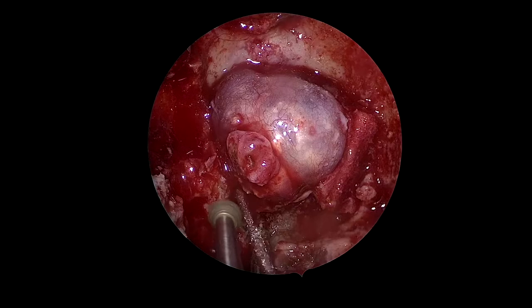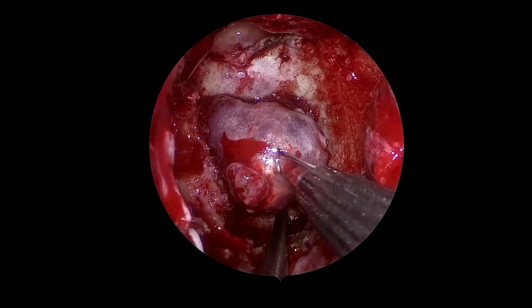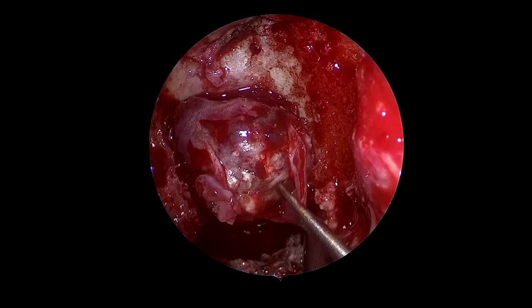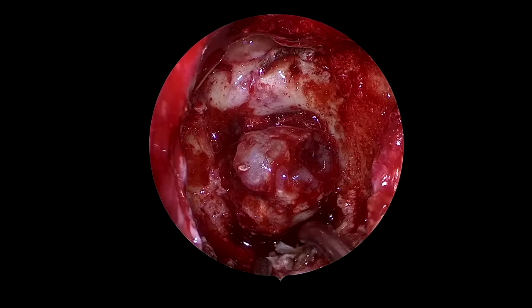We start the case by performing a transclival approach surrounding the tumor completely. We have removed all abnormal bone inferiorly and laterally to the tumor. Now we proceed with opening the capsule of this tumor, aiming to remove the extradural portion of the tumor first.